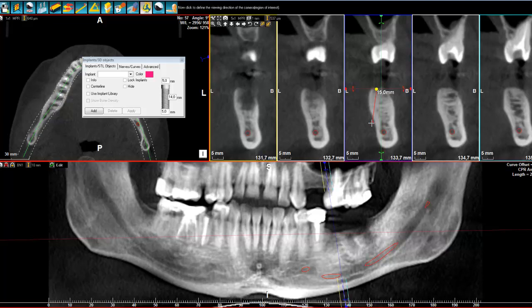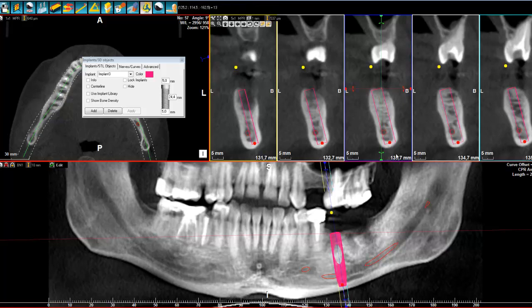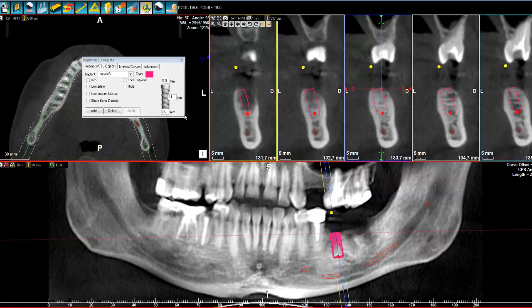Here you have your module where you can simply check for the right length. You can select, for example, a length of tenths of millimeters and spend some time trying to get the right dimension. I suggest you simply get the orientation right first. Our implant is currently 24 millimeters — I can click once and change it to 11, and there you get your implant that is smaller. You can also select a smaller diameter — I'll click 4 — and there you see the cone shape of the implant starting.